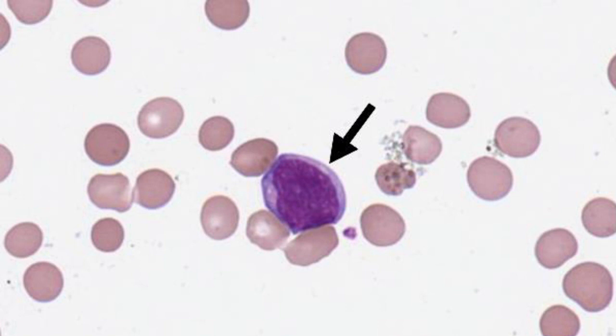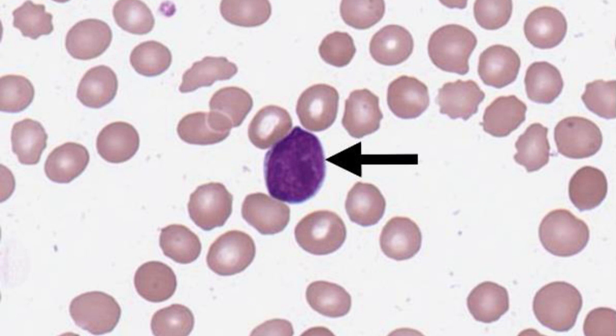As lymphoblasts may be quite variable in appearance, it is often impossible to correctly classify an individual cell based on the morphology alone. Review of other cells within the sample may help in this regard. Finally, supplemental studies, such as immunophenotyping, are useful to arrive at a definitive diagnosis. Lymphoblasts can sometimes be indistinguishable from other types of blasts and lymphoma cells.